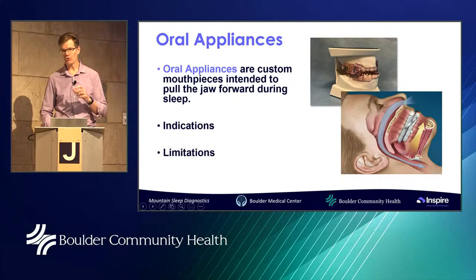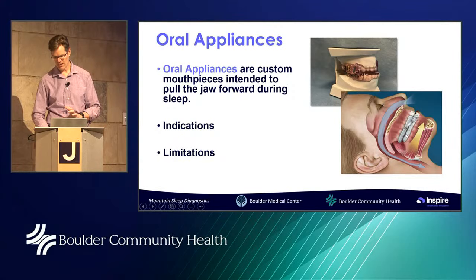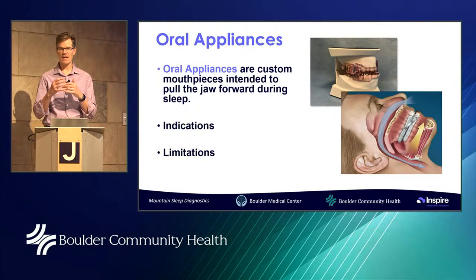And in doing so, the lower jaw is pulled forward, as you can see in this arrow. The tongue is attached to the lower jaw. There are also muscles in the tissue between the soft palate and the lower jaw that will tend to pull the soft palate forward a little bit, more so with the tongue, but it can create that space. We're trying to recover that real estate in the back of the throat between the palate and the tongue, and this helps pull those forward, creating some space, stabilizing the airway, and keeping it from collapsing.